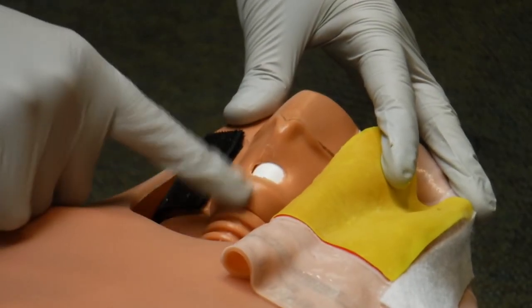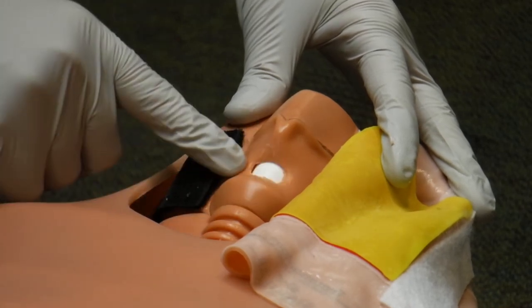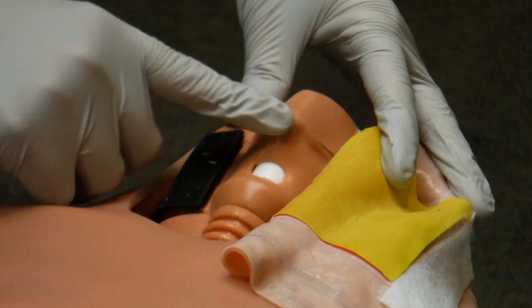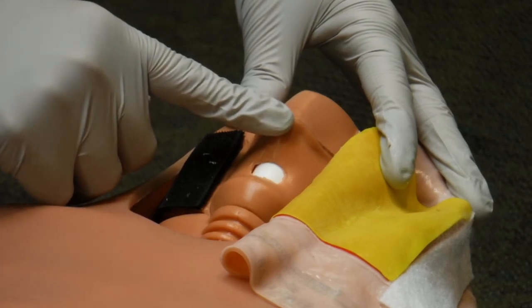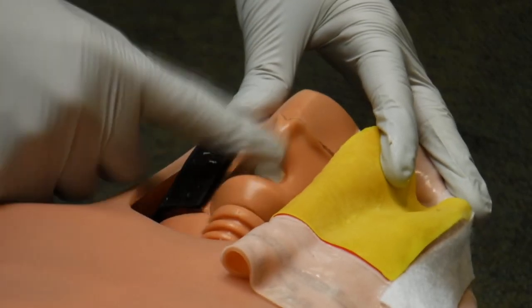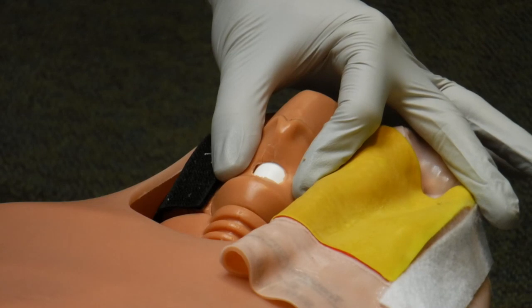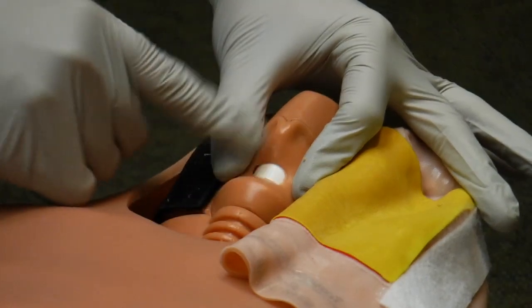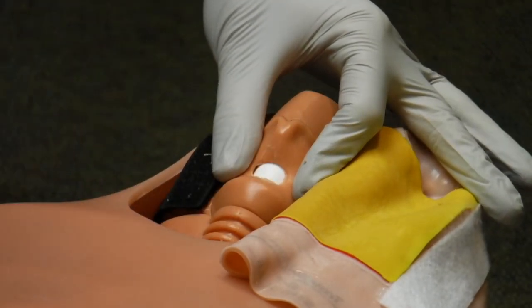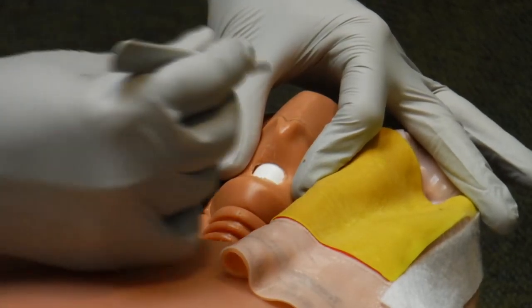Here's the trachea. This is the first hard thing, which is our cricoid cartilage, then the divot over the cricothyroid membrane, and then the next hard thing, which is the thyroid cartilage. So as we work our way up, our finger hits something hard, a divot, hard, and we're going to stabilize that with our left hand, since I am a right-handed surgeon, and then I'm going to work over the cricothyroid membrane.